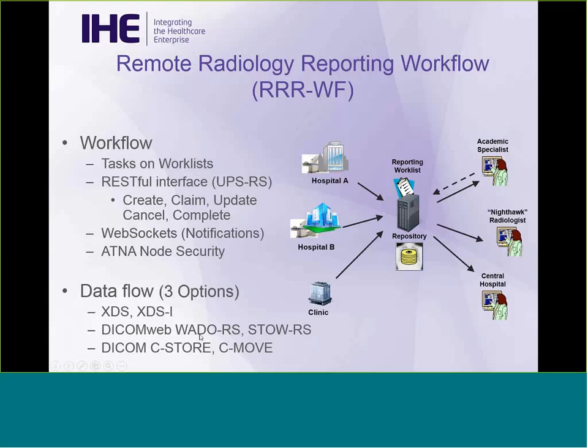The second option within the profile is using the DICOMweb RESTful services. So this is sort of the newer capabilities within DICOM that are aligned with the HL7 FHIR activities. And so this allows RESTful WADO, which is web access to DICOM images, so a RESTful pull of images, and STOW, which is store over the web, a RESTful push of images. And so we're starting to see servers support these capabilities. Once FHIR reaches its final text status, then we expect to see a lot more integration using those types of services.